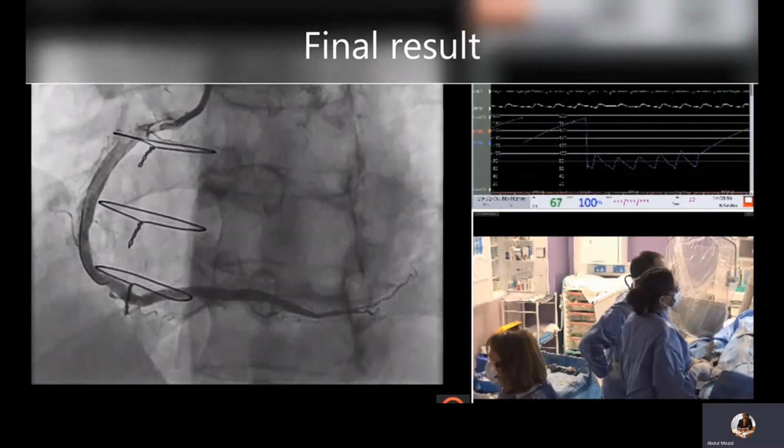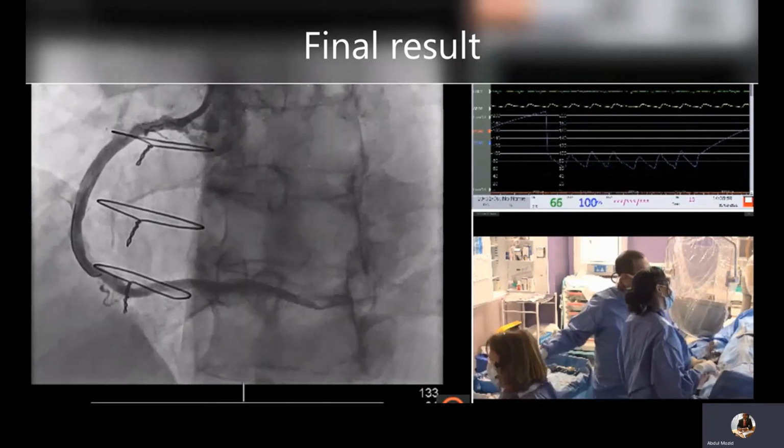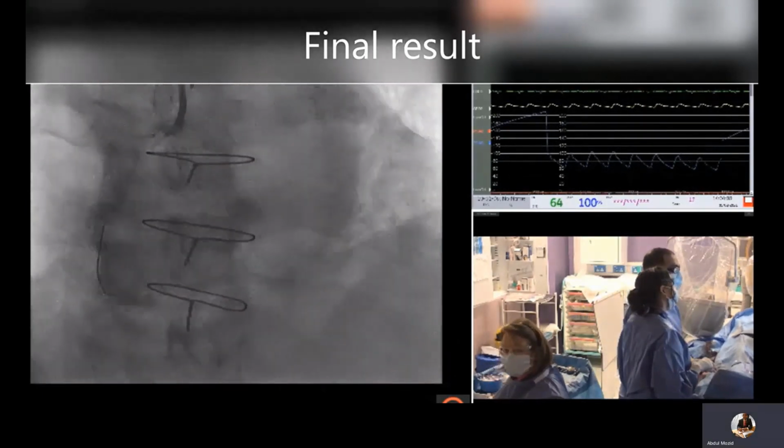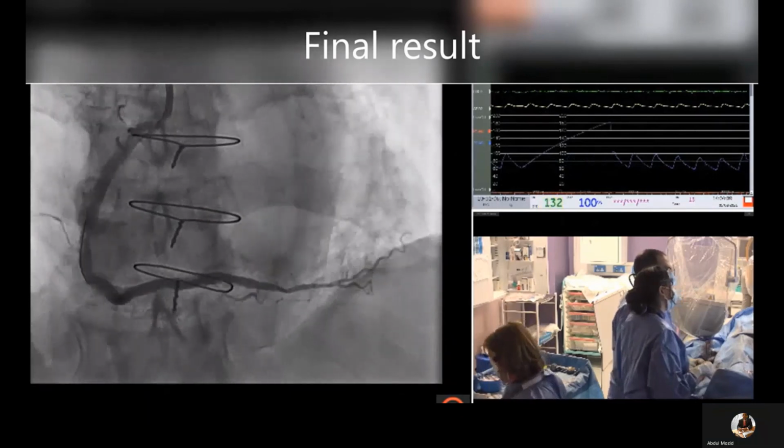And here is the final result, showing an excellent result with a patent right coronary artery and PLV. The vein graft to PDA is patent, so we did not pursue opening this branch. And an excellent final result.